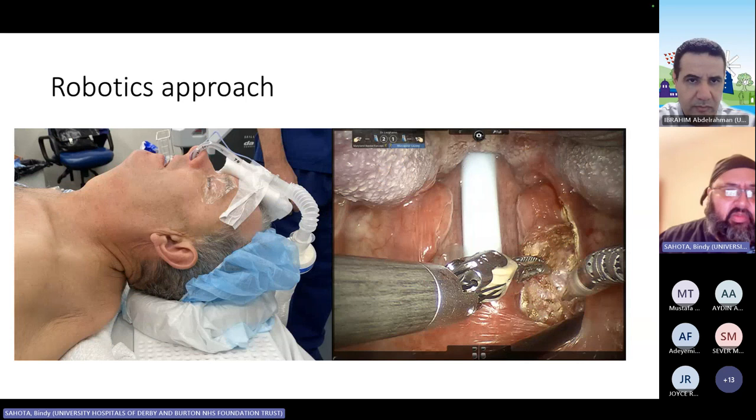So this is a patient from the Royal Adelaide Hospital on the left, and this is their standard setup. So we use nasal intubation as the primary mode, and we then set up to use the robot primarily intraorally as a whole.